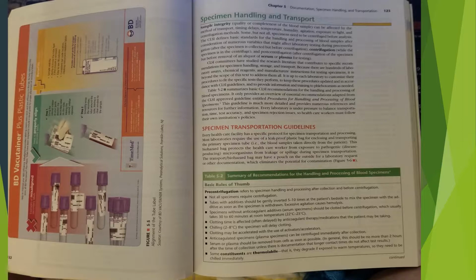The CLSI defines basic standards for the handling and processing of blood samples after considerations of numerous variables that might affect laboratory testing during pre-centrifugation, after the specimen is collected but before centrifugation, centrifugation, while the specimen is in the centrifuge, and post-centrifugation, after centrifugation of the specimen but before removal of an aliquot of serum or plasma for testing.